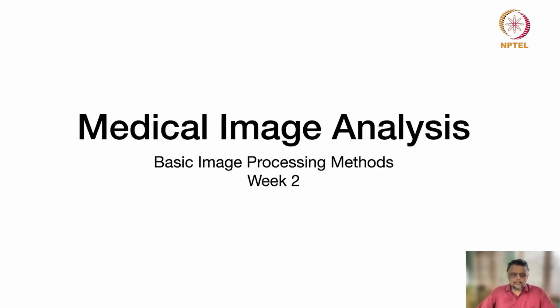And welcome back. This is week 2 of the medical image analysis course. So last week we were looking at the various medical imaging modalities, namely MRI, CT, ultrasound, and some nuclear medicine imaging. And we saw what the mechanisms are of image generation, right? Other than ultrasound, most of the other imaging systems require a reconstruction process, right? There's no direct image acquisition. And we looked at the nature of those images, the nature of contrast, what the pixel values mean, etc.